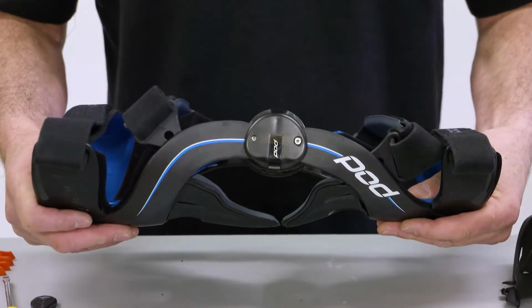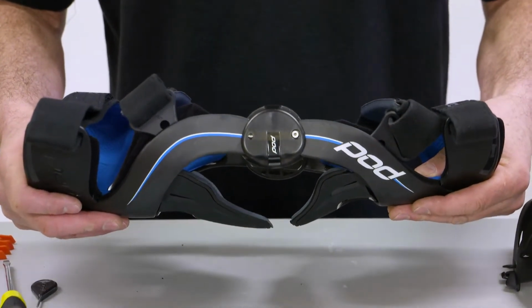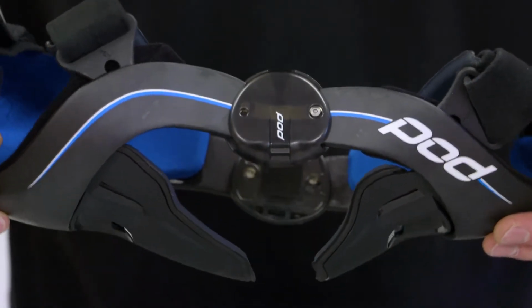Now that we've reattached the hinge housing and the ligaments to the upper and the lower frame, check the brace for natural human motion. Make sure that the hinge housing and new ligament are functioning correctly.